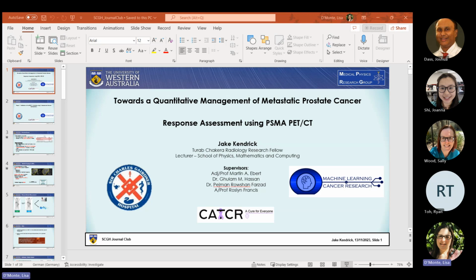In this particular study, we performed the progression assessment in 2 different ways. First of all, we had an expert nuclear medicine physician go through the scans and undertake a semi-automated delineation methodology. This began with a 3 SUV body weight threshold, and then following that, there was manual removal of physiologic uptake and inclusion of missed pathologic uptake into those segmentations. And they were interpreted according to a standard criteria for interpreting these images, the PSMA framework.